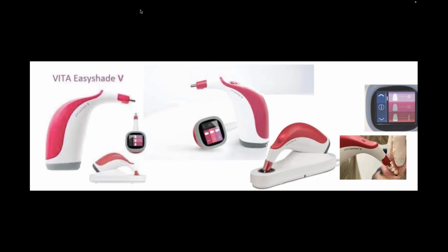And by the way, I could also use it to photograph my restoration at the end and see if I get a very similar measurement. If I do, it makes me feel a lot more confident. So I do use the Easy Shade a lot. There are also some other tools that I'm going to touch on a little bit. I have to speed up so we don't run out of time here.